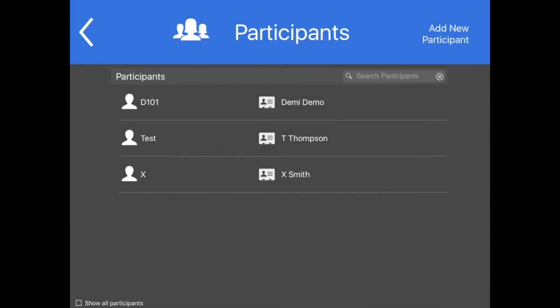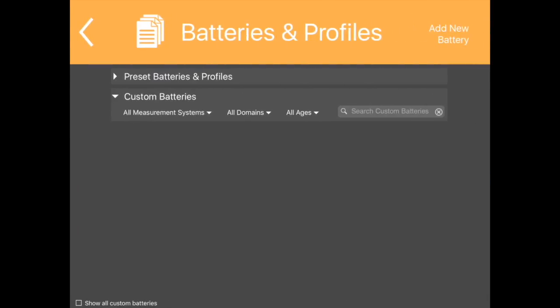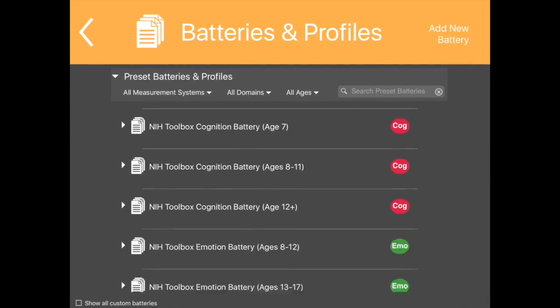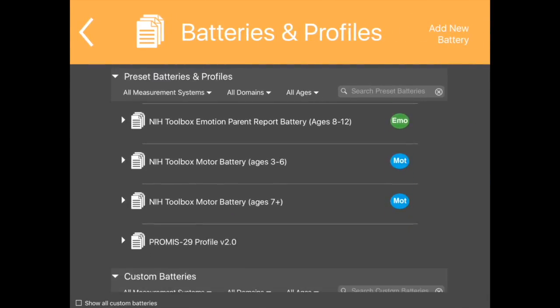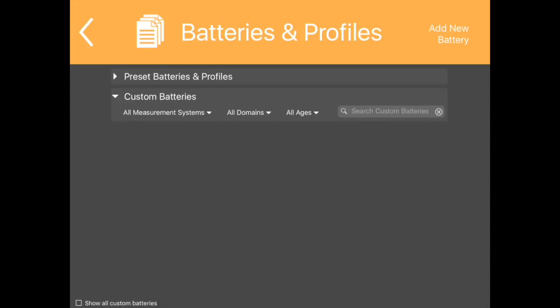For a quick way to view all the batteries available on this iPad, tap the Batteries and Profiles button. You can filter which batteries and profiles you want displayed. If no custom battery has ever been created on this iPad, the Custom Batteries list will be empty.